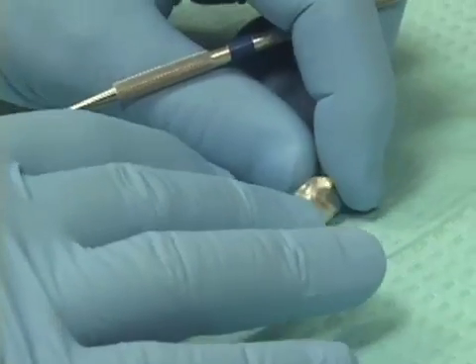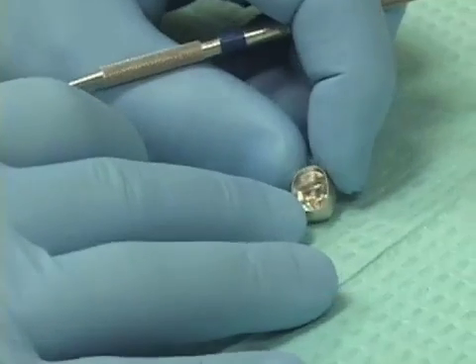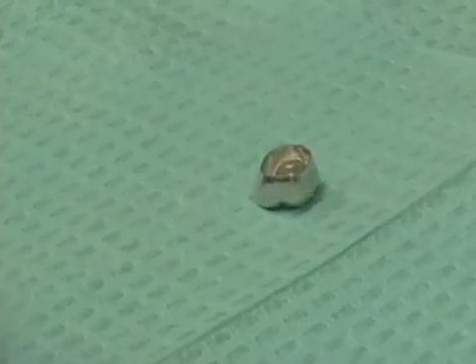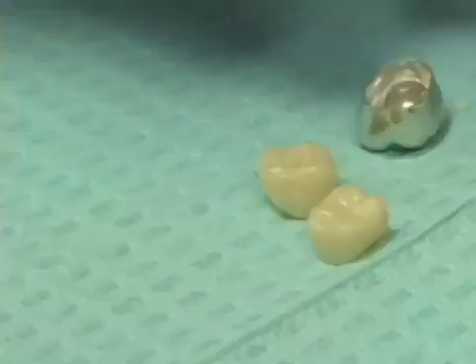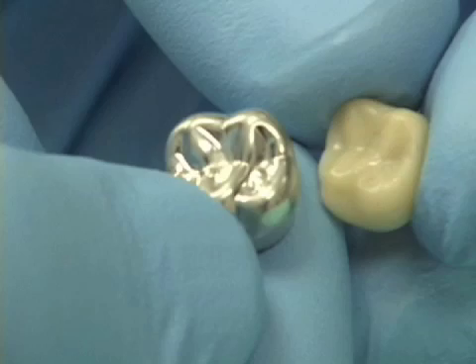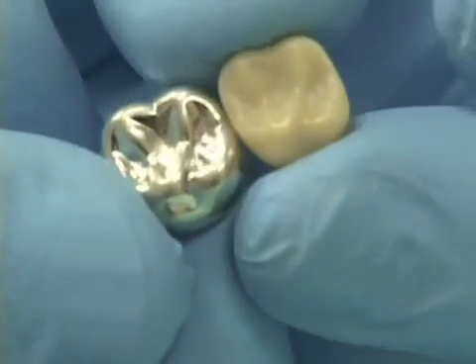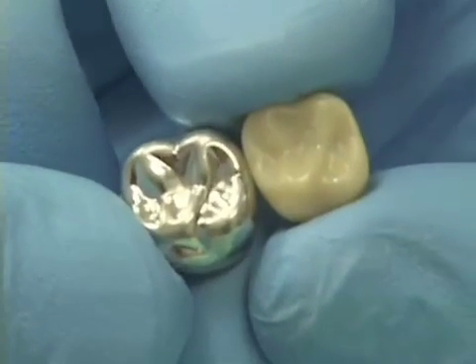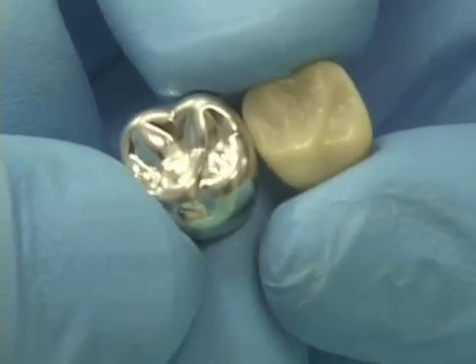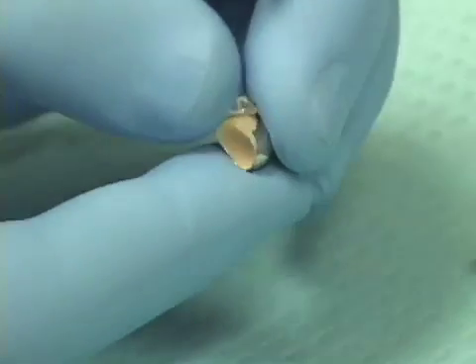Basically, pour the self-curing acrylic into the aluminum shell crown form and then, when it's set, peel away the aluminum shell crown form. So what we have is: fill the aluminum shell crown form with acrylic, allow the acrylic to set up, and then just peel away the aluminum shell crown form, giving us a pretty good copy of that tooth in our repair acrylic.